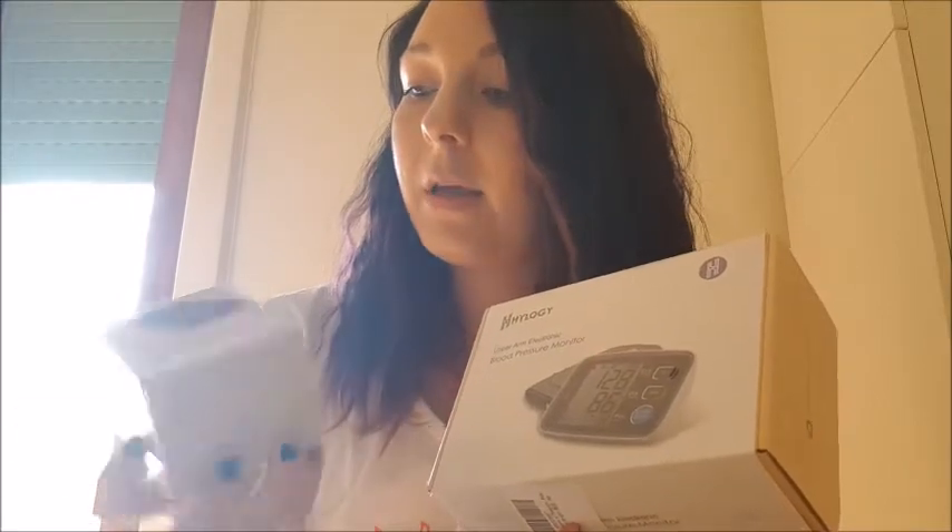Just by looking at the boxes I like the packaging already — it looks pretty professional. Here we go. The box just slides off like that, which is cute. I really like the box, it's got the brand name on it.